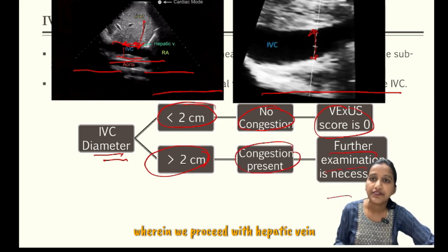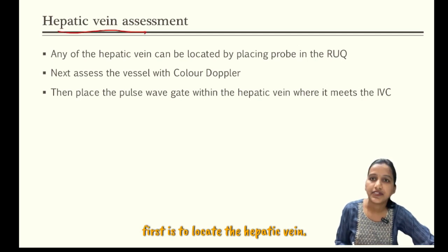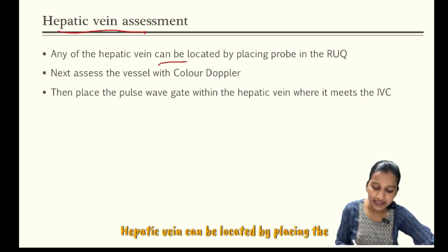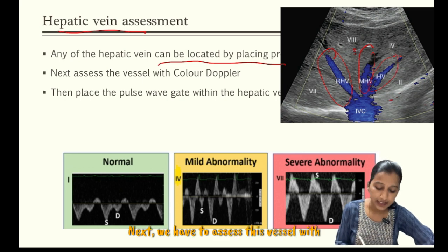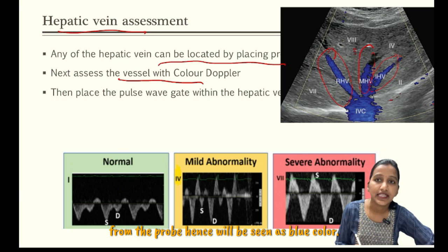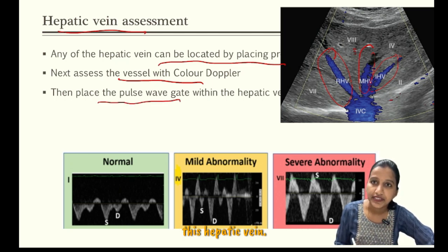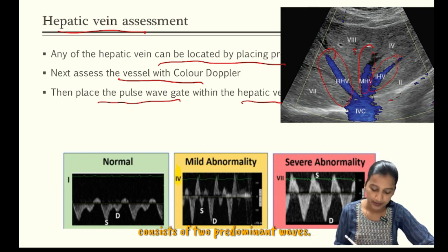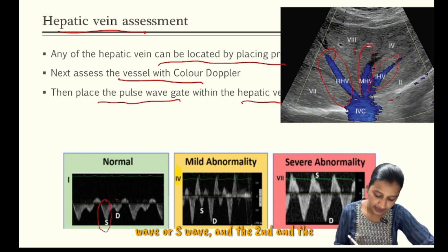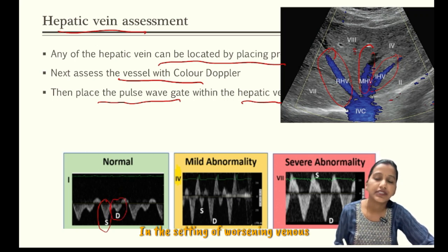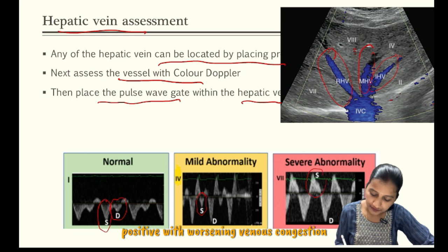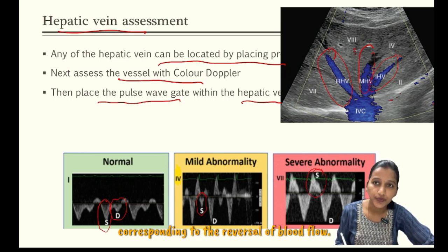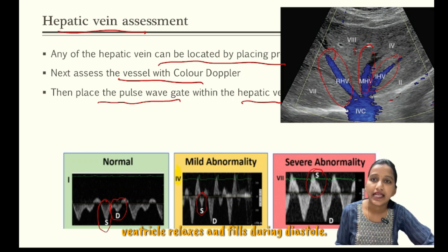Next, coming to hepatic vein assessment — the hepatic vein can be located by placing the probe in the right upper quadrant, wherein any of the hepatic veins can be chosen. We assess this vessel with color Doppler wherein the flow will be away from the probe and hence will be seen as blue color. Then place the pulse wave Doppler gate over the hepatic vein. This physiologic waveform consists of two predominant waves: the first and larger wave is the systolic wave or S wave, and the second and smaller one is the diastolic or D wave. In the setting of worsening venous congestion, the magnitude of the S wave will decrease as systolic phase venous flow decreases and eventually will become positive with worsening venous congestion, corresponding to the reversal of blood flow. At this point, venous congestion is severe enough that flow will be away from the IVC and forward flow will only occur as the ventricle relaxes and fills during diastole.